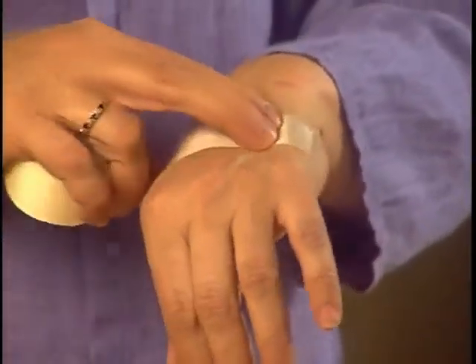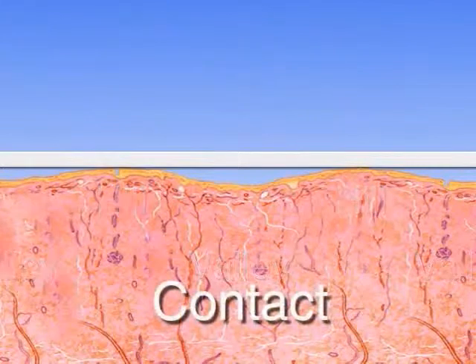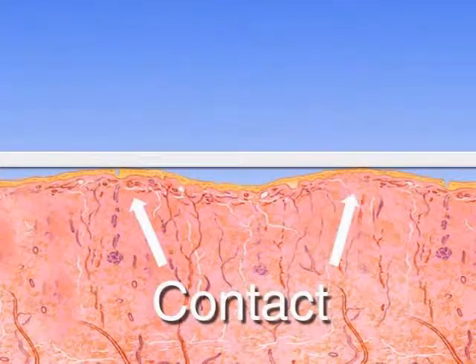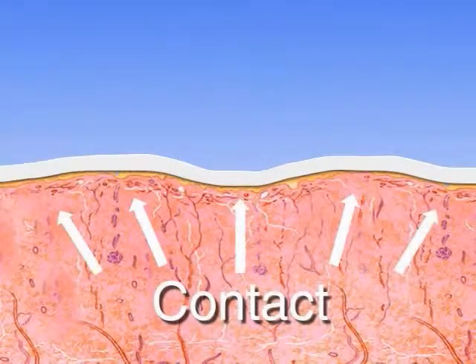Gently but firmly stroke the tape. Skin has hills and valleys. Laying a piece of tape on the skin only gives you contact with the top of the hills. Gentle but firm strokes along the tape allow the adhesive to come into contact with more of the skin's surface. This will increase initial adhesion and decrease the risk of rolling or losing your tape to friction.